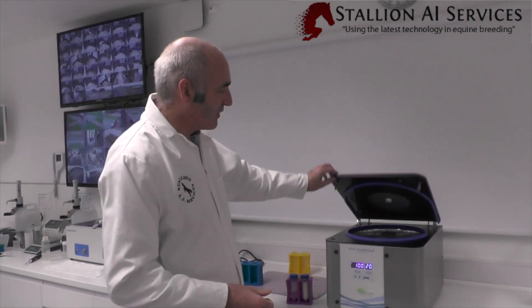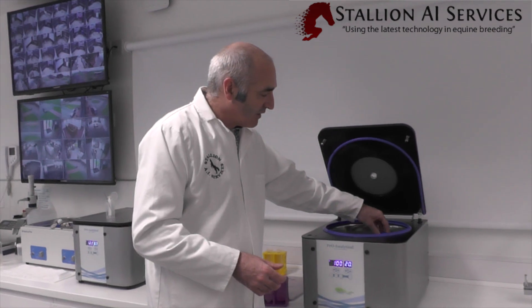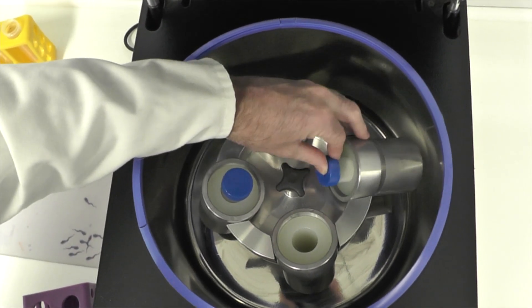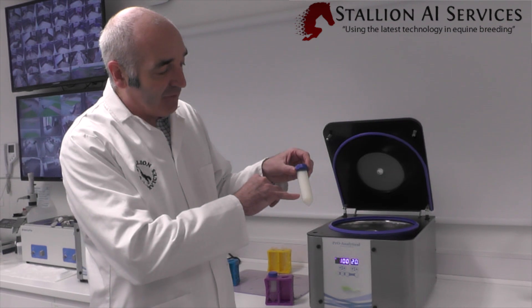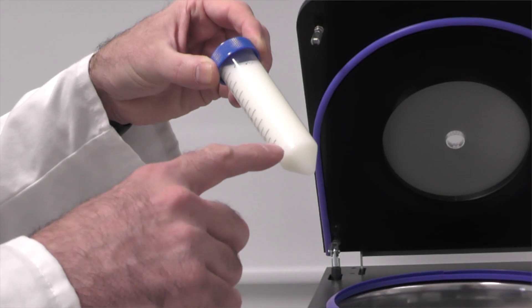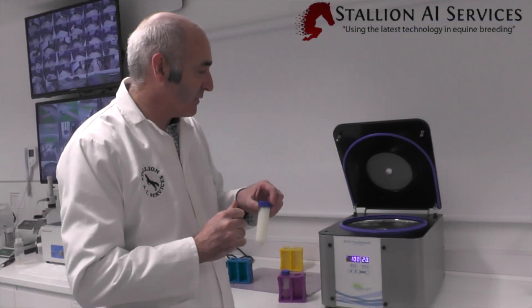It is also important to make sure you have swing-out rotors. When the semen goes into the buckets, they spin outwards rather than being fixed. This makes a big difference — with a fixed rotor you'll see a line of semen going down your test tube, whereas with a swing-out rotor you want all the semen as a pellet at the bottom, which makes it much easier to aspirate afterwards.